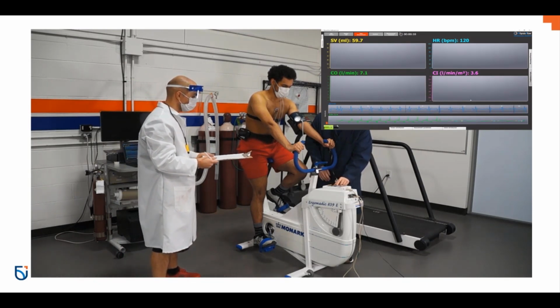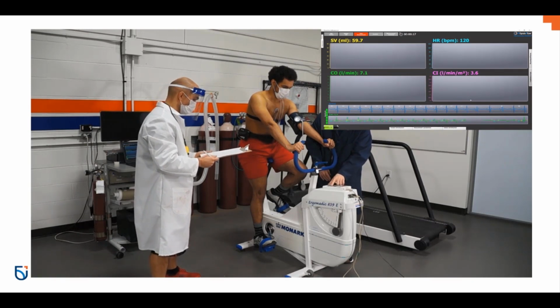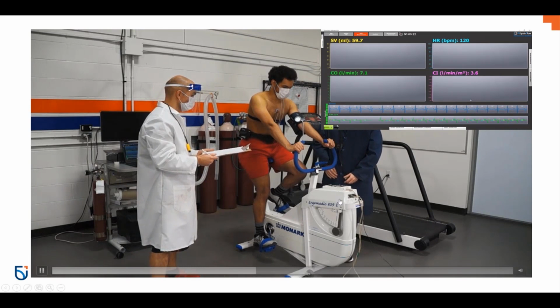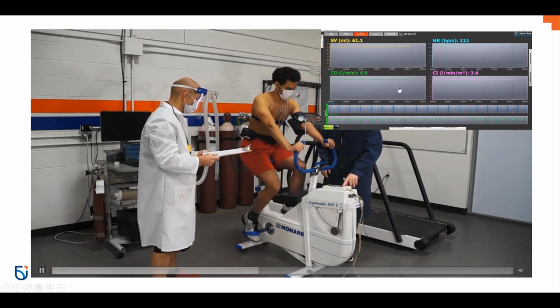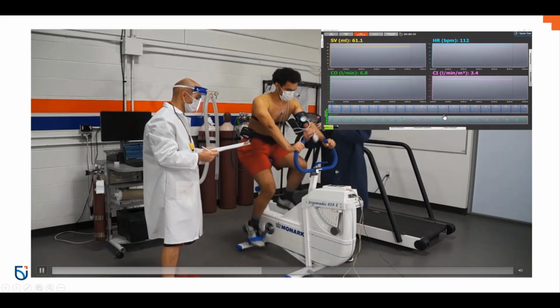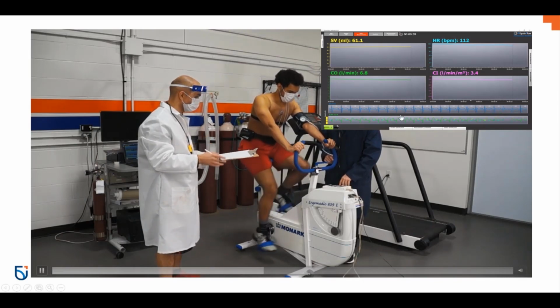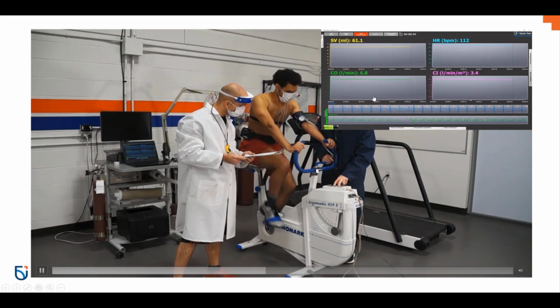That's typically totally fine. People aren't always the most comfortable with the test, and if they know they have a high resting heart rate, it's not necessarily something to take issue with. So here you can see me setting the bike, setting the wattage to the 50 watt warm-up, and we're going to start the warm-up. And once I've inputted all of his data, it runs through 30 cycles of calibration, which we cut out here and didn't show. It essentially calibrates for 30 heartbeats while he's on the bike at rest, and then we have him on, and you'll see that these averages change through the test.